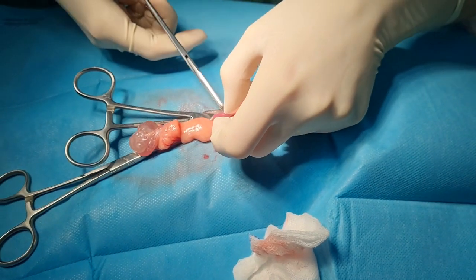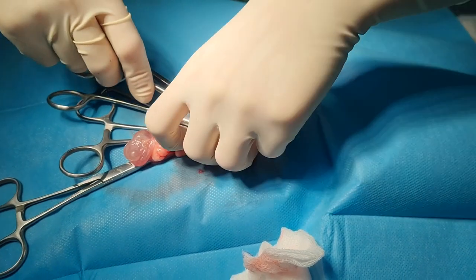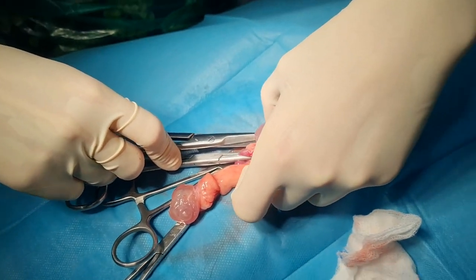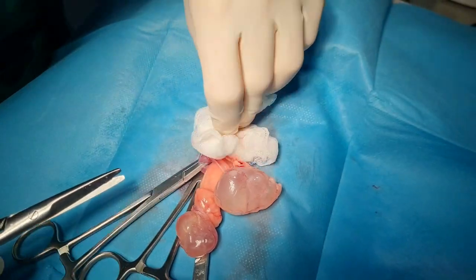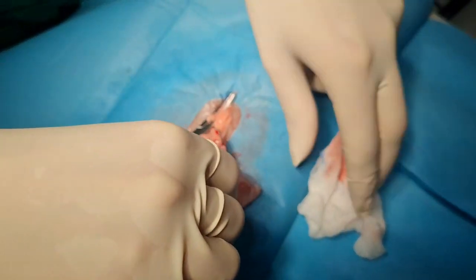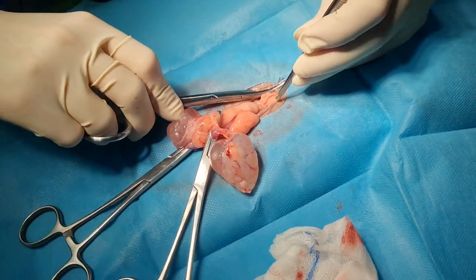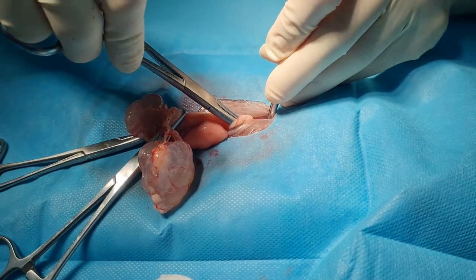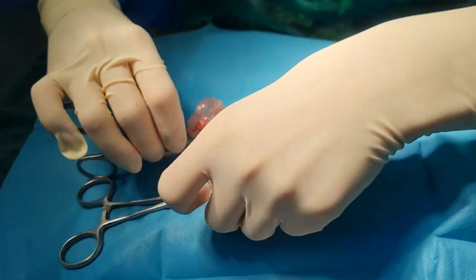So ovary number two can go goodbye. We thought we might have ruptured it pre-op, but I think either it had moved or it was bigger than that to start with. They're a decent size, but we see a lot larger. I've also seen a lot smaller that have been causing significant pain, so size is not everything.